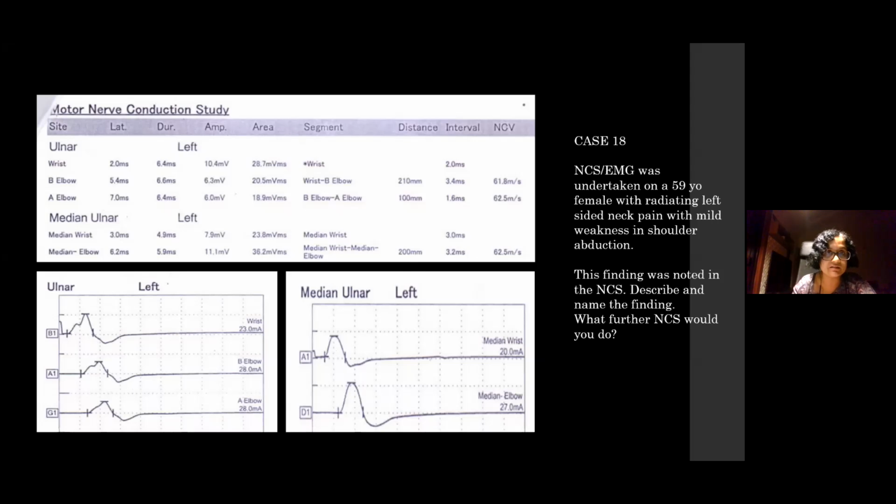So MGA, the most common MGAs are of 3 types. There's a 4th type, proximal MGA, which is much less common. After this, you should go and have a quick look at MGAs. In case somebody hands you something like this, you need to be able to identify that MGA, because that will have repercussions, as somebody might diagnose this as ulnar neuropathy, which it is not.